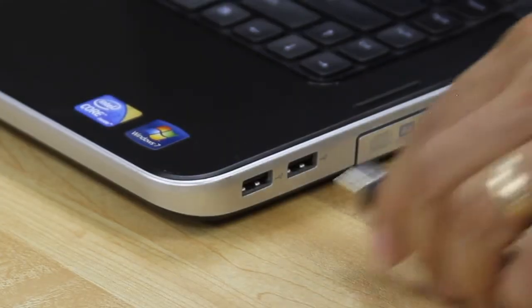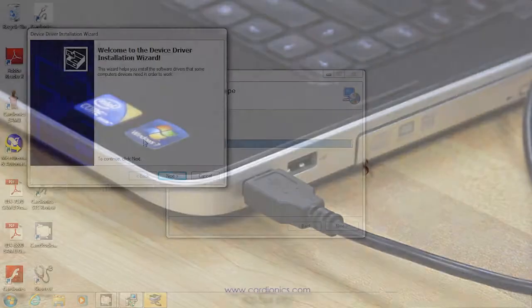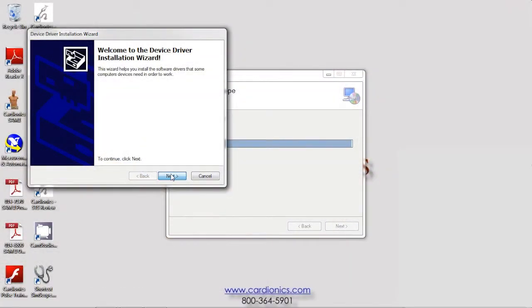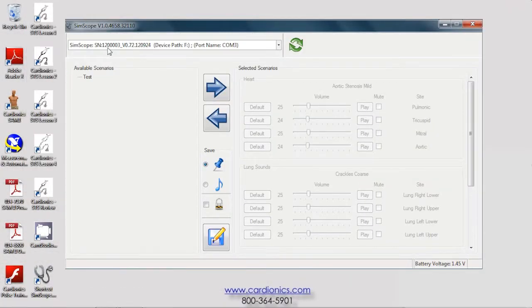Connect your SimScope to a USB port. SimScope is recognized and the serial number is displayed in the upper left dialog box.